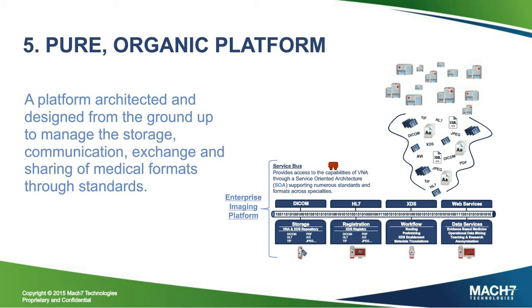Well, absolutely. From an enterprise imaging standpoint, we are all very well aware that it is not a DICOM world anymore. Our clinicians request to be able to view and exchange images that are acquired with visible light. There are other sources of imaging, or even waveforms, that need to be archived and are clinically significant for patient care today, especially for collaboration between different specialties. And our enterprise imaging system needs to deliver that information to clinicians without any delays.